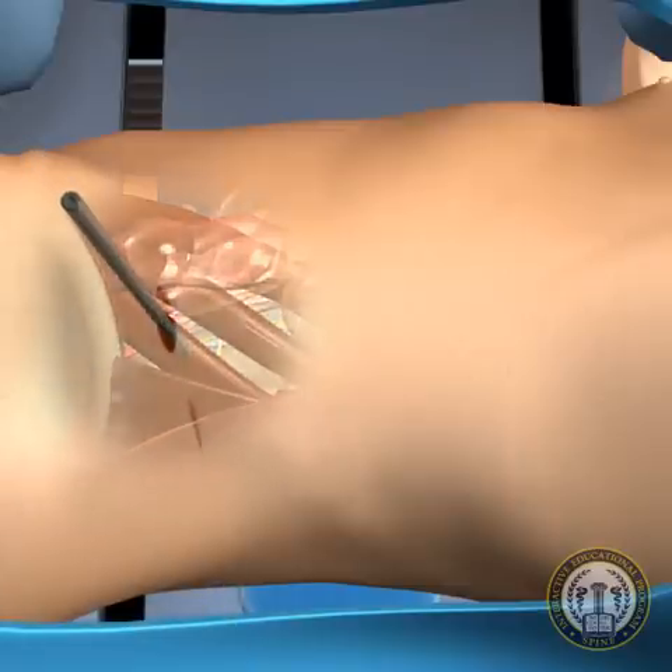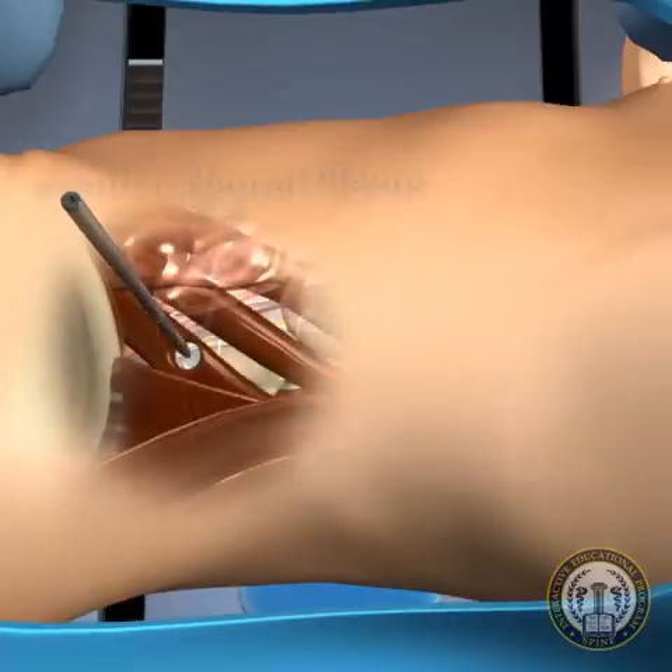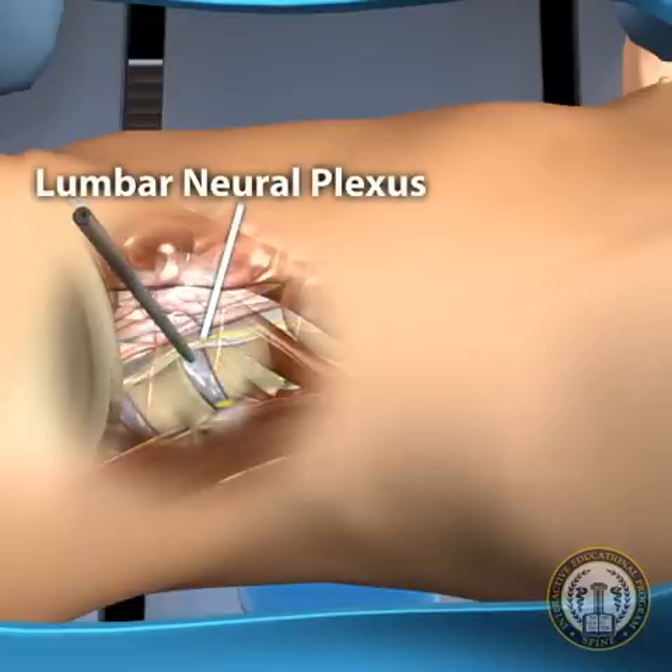Utilizing fluoroscopic guidance, the disc space is visualized in relation to the dissector cannula. With the use of a live neurological hunting algorithm and the fluoroscope, the dissector is passed through the muscle onto the disc without disruption of the lumbar neural plexus.